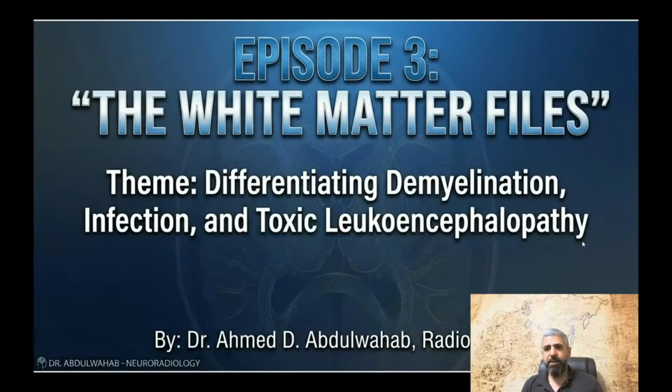Welcome back, detectives. We conquered the rings and the deep structures. Today, we will enter the forest of white matter. When the brain's wiring turns bright, it could be a simple virus or a deadly autoimmune attack. So let's find the clues in today's episode of the Radiology Detectives. It's called the White Matter Files.